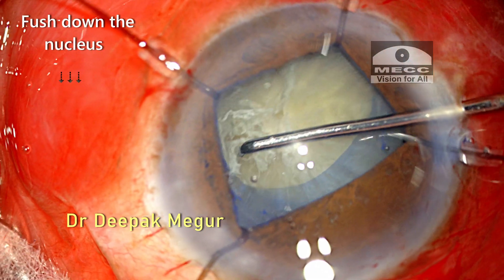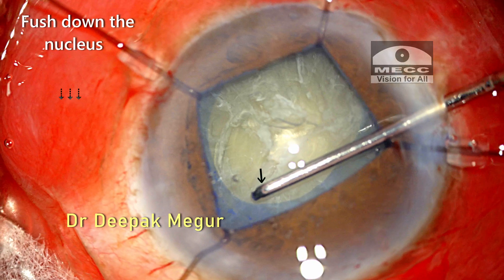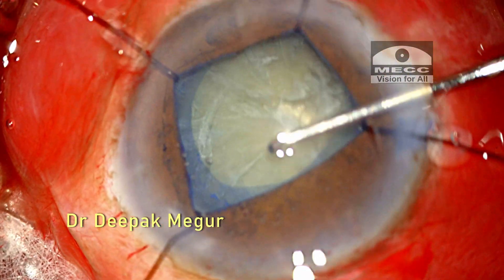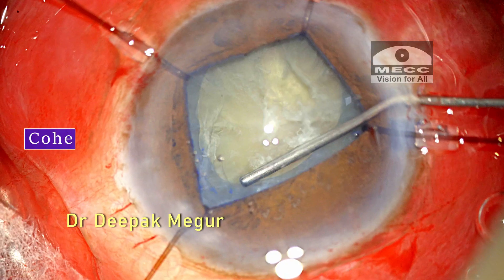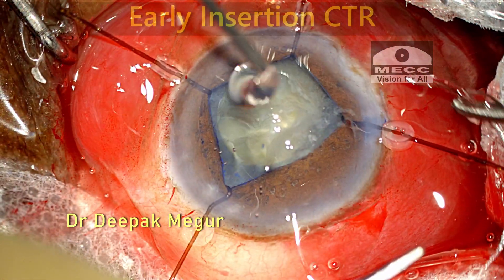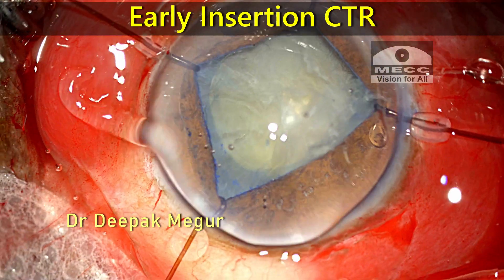While rotating the nucleus, I push it down gently and then rotate, so that there is the least amount of stress on the zonules during rotation. I can see that the capsule is stable and does not move when the nucleus is moving. Now I'm creating some space under the anterior capsule by injecting cohesive OVD.